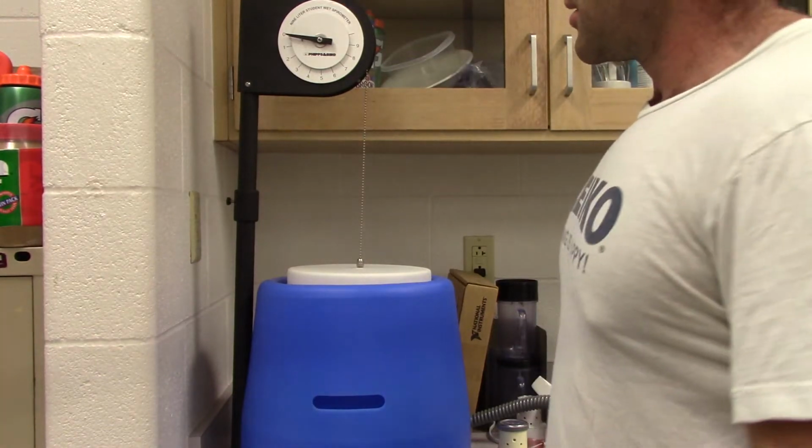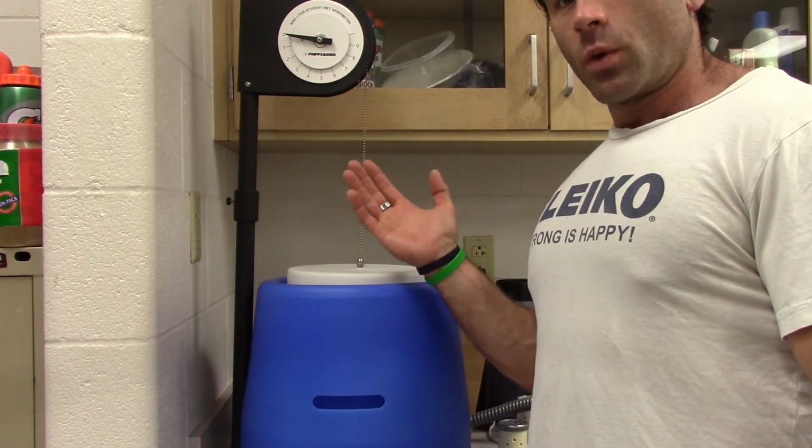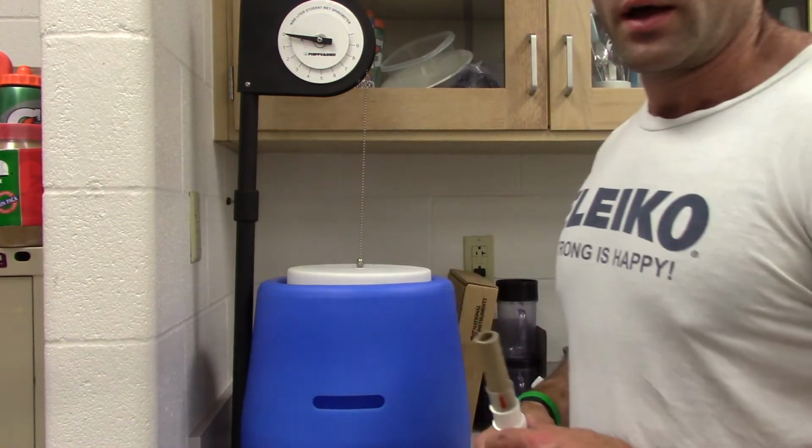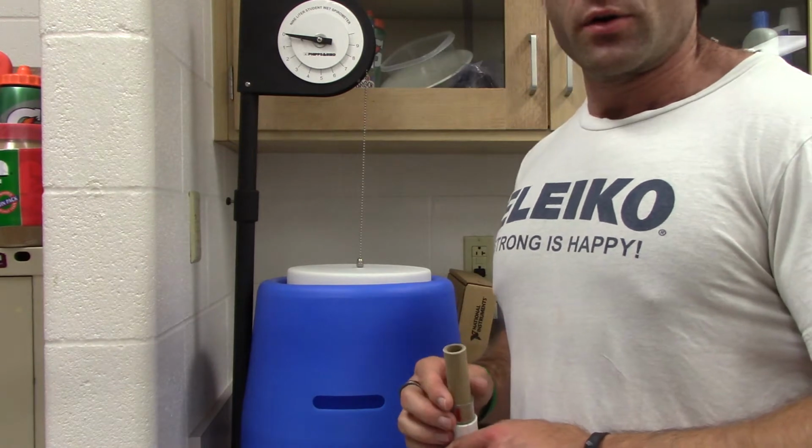Howdy folks, what we have today is the spirometry lab. Now the spirometer is what we're going to exhale into, and from there it's going to measure the amount of air that we're taking with each breath.